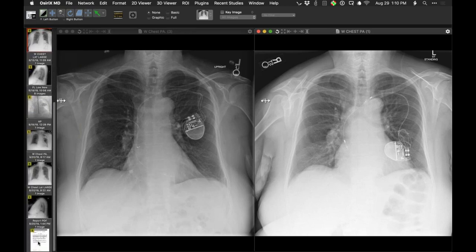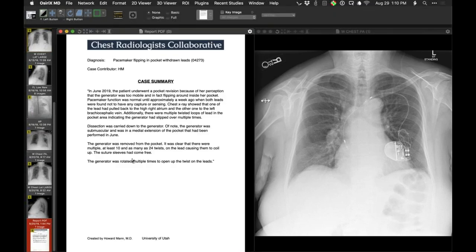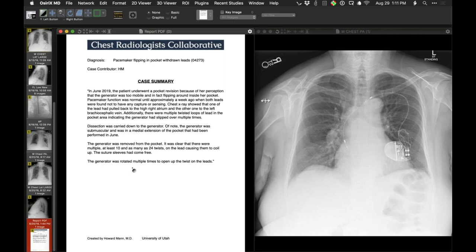In this patient, as you'll see from the description, it's likely that in this very capacious pocket, the pacemaker just turned around itself in everyday life — when you walk around, lie down, get up, sit. If the pocket is really very capacious, the pacemaker device can flip around. The generator, mobile in fact, flipping around inside the pocket. You can see there was a medial extension of the pocket performed in June, and even the suture sleeves had come free. A very capacious subcutaneous space allowed the pacemaker to turn around, which had to be fixed.